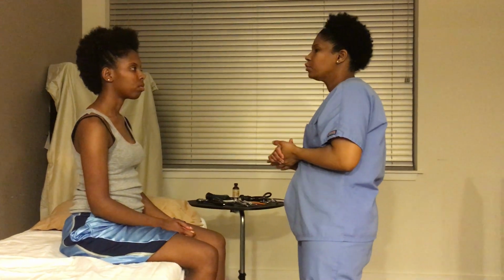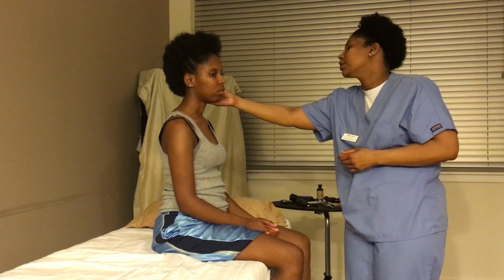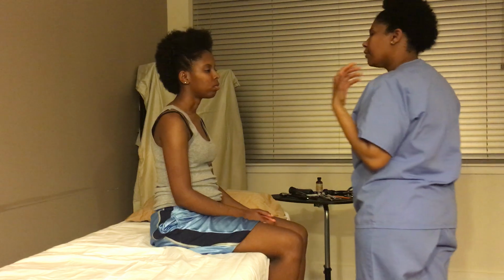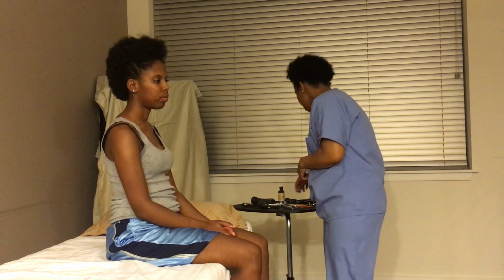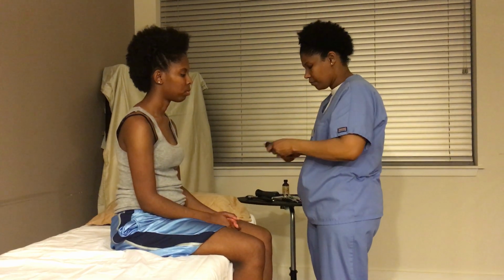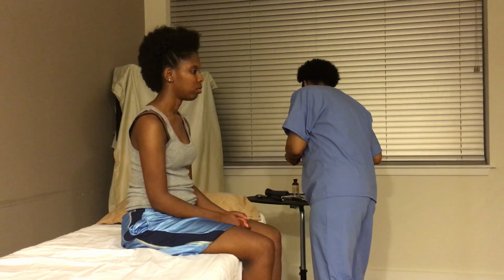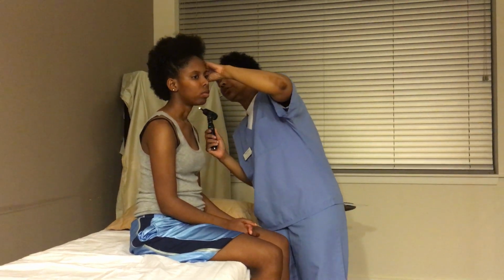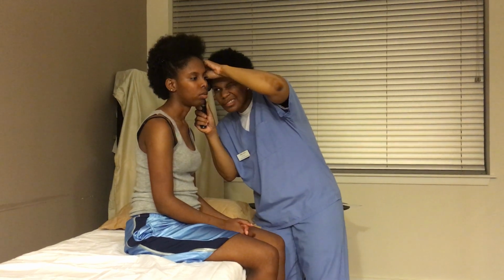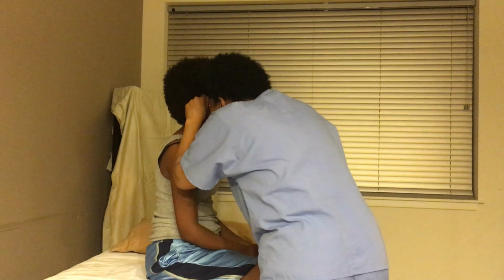We're now going to look at your ears. Just going to look at the external canal of your ears, looking at your auricle, your pinna, looking for any drainage. Are you having any discomfort or pain in your ears? No. Okay, we're going to go ahead and look inside your ear. Going to look at your tympanic membrane, which should have a nice pearly white appearance, which yours does. Looking at your umbo, your malleus.